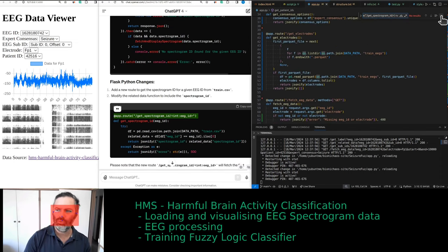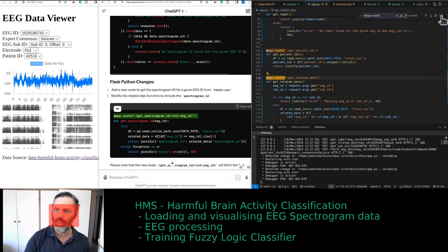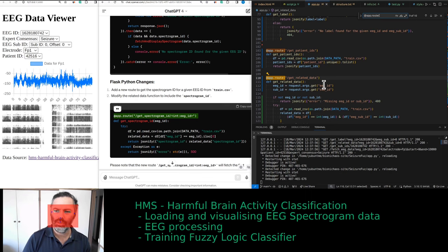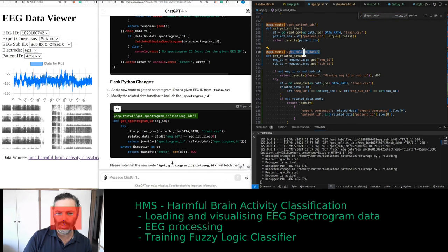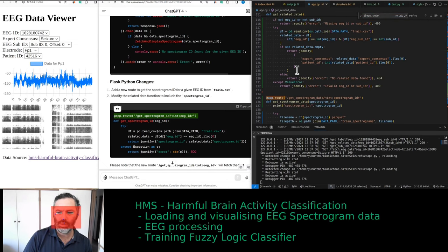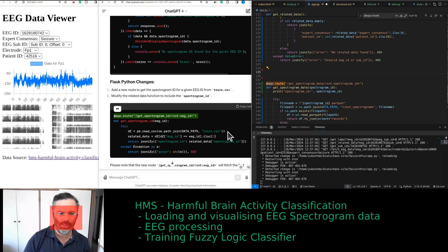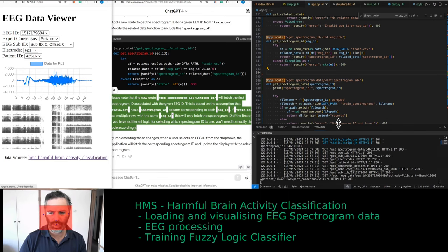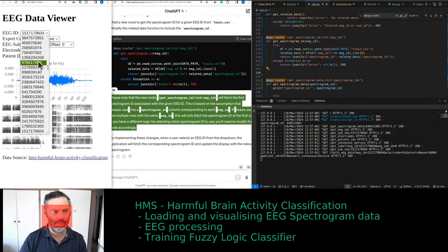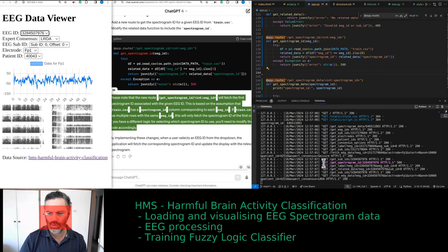How many routes do we currently have? There are get patient ID, get related data — it's a weird one. Get spectrogram data — this one is getting the spectrogram ID. It's working okay the first time around, but when you select a different EEG ID, it gives an error.